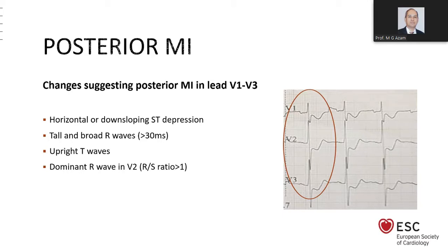But sometimes in that particular ECG and some other ECG, you cannot get tall R in V1 and not too much upright T. So that makes you confused. So once you get V1 to V3 ST depression, and you don't find any other reciprocal change, then you should go for posterior leads to exclude posterior MI. That is the usual approach of our fellows. Please don't ignore it. Try to practice it in your regular practice. Then you will be able to discover some extent of true posterior MI. That is the classical message for this. I mean, our message.